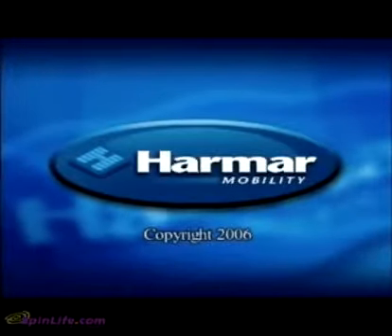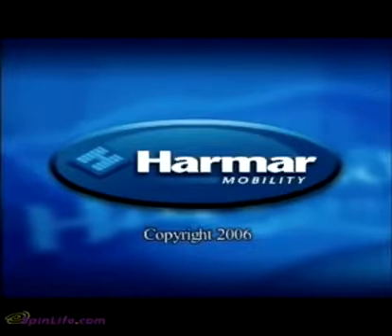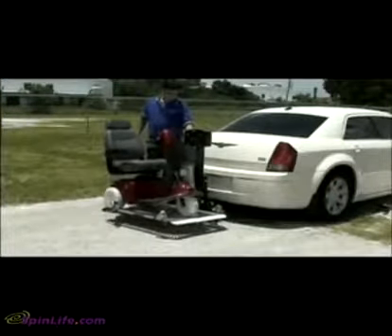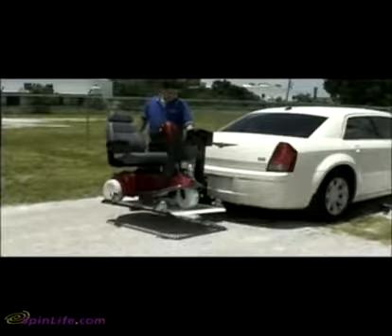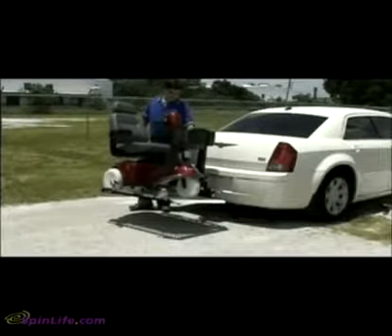An installation guide has been created to assist you in installing a Harmar lift. If you have any questions after viewing this video, please contact Harmar's Technical Services Department. The AL300 Fusion Lift is designed to transport both power chairs and scooters. Estimated installation time is 45 minutes, but a first-time installation can take significantly longer.